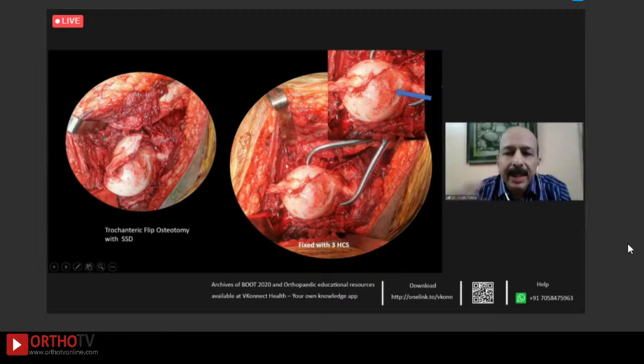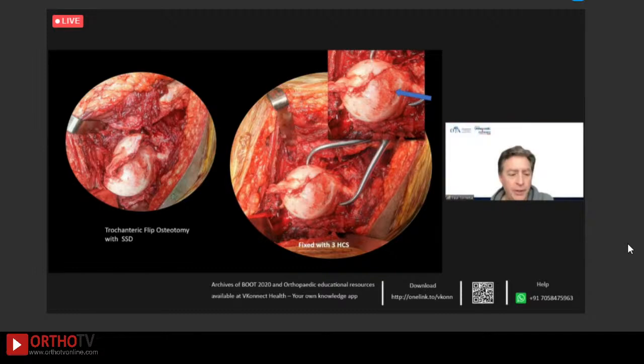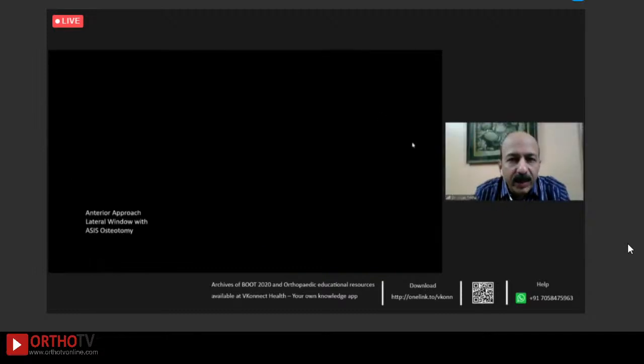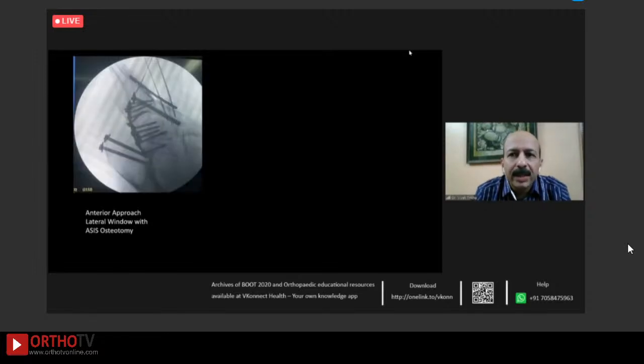But in this case, where we had to go posteriorly, I think doing a trochanteric flip was a natural further thing which we could have done. Yes, very good plan. The next thing was I tried to get my reduction, but was not able to get an accurate reduction of the anterior column. As I said, I wanted to get the best. And as Paul said, it is just 45 minutes for an anterior side to just fix it. And this is what we fixed through the lateral window with ASIS osteotomy.